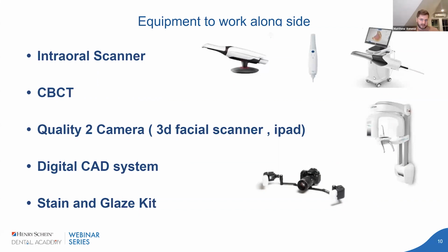So you got your printer. You don't just plug it in and expect it to work. What do you need? I don't want to say the word need. I don't tell the patients they need dental treatment, but it's a strong recommendation, something that we all should have at this point to be able to work alongside your 3D printer.